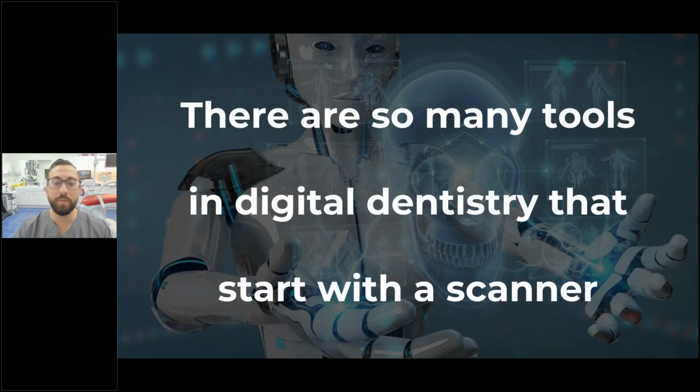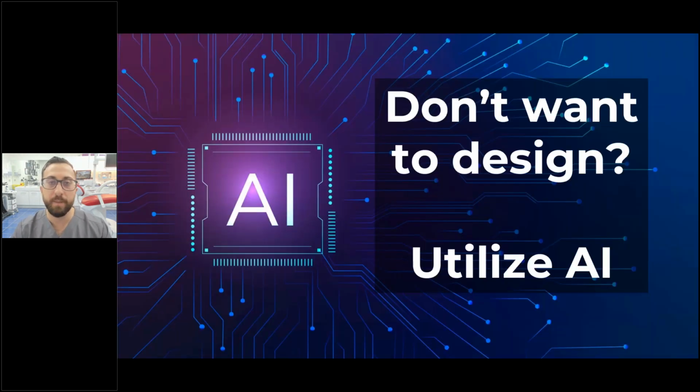So there are so many tools in digital dentistry that you have to start with a scanner. If you want to get into 3D printing, you have to have a scanner. If you want to do any form of CAD/CAM, you have to have a scanner. So a lot of the times what stops people from getting into CAD/CAM, as I mentioned, is CAD design. This is the scary part for most dentists. They don't want to be a technician.